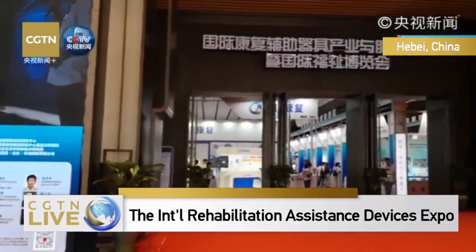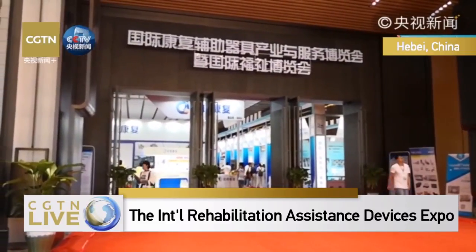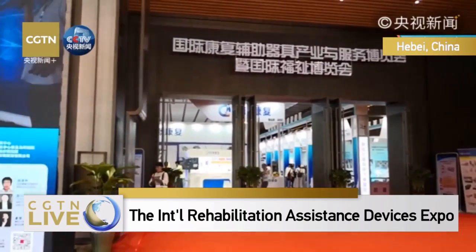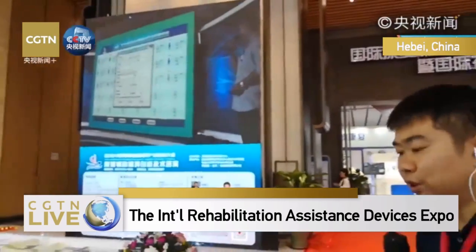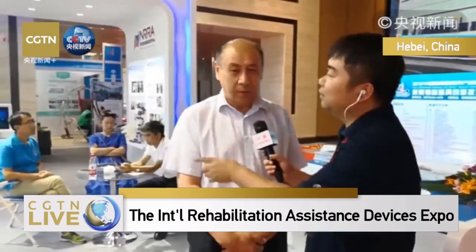...demonstrating their latest update and advanced technologies so as to expedite the marketization of these technologies. And today with us is Mr. Ma Yan, Vice Director of the Rehabilitation Assistant Technology Association of Qinhuangdao. Can you brief us on the categorization of rehabilitation assistant devices?